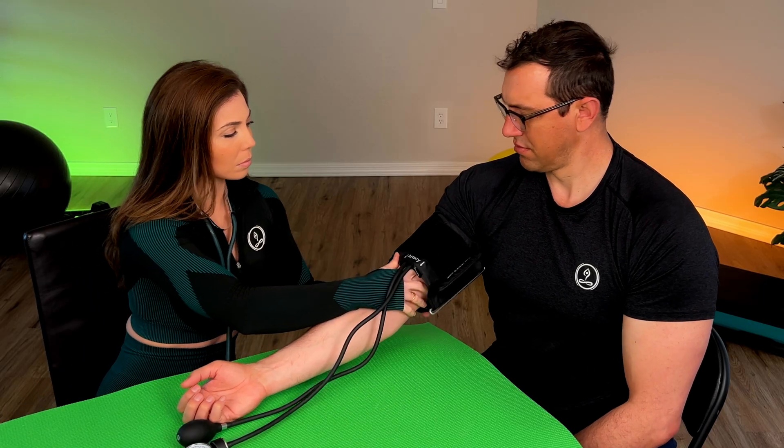So there you have it. The manual method, if done correctly, is highly accurate and often used in clinical settings, but it's not practical to do on yourself. That leaves the Omron Digital Upper Arm Cuff as a solution for practical at-home use, and there is scientific research to indicate its accuracy. The blood pressure cuff you choose is entirely up to you and your individual circumstances, but if you follow these key principles for collecting measurements accurately, you'll be much better off and on the road to managing hypertension. For those trying to collect a general baseline, make sure to take the blood pressure reading around the same time every day for consistency, and should you find anything alarming with your readings, be sure to contact your healthcare professional.